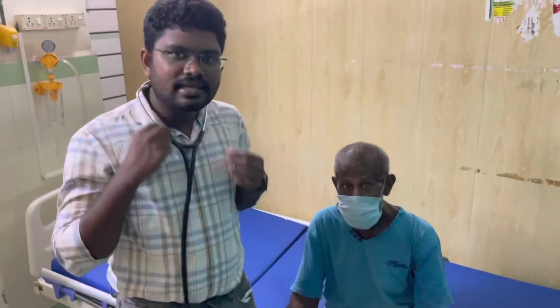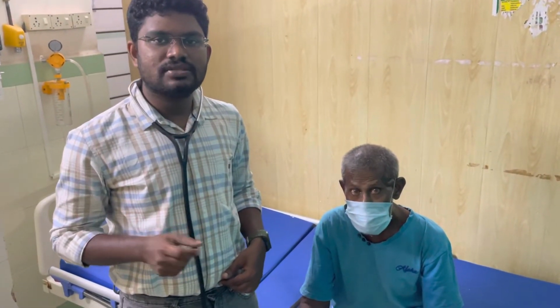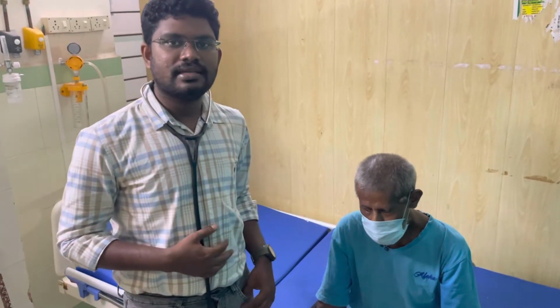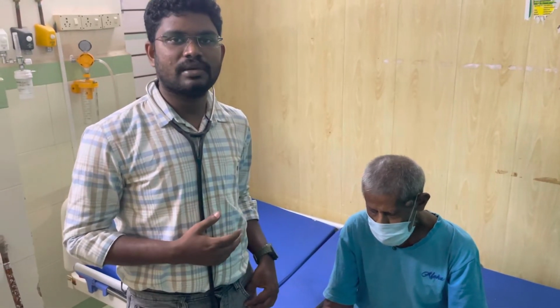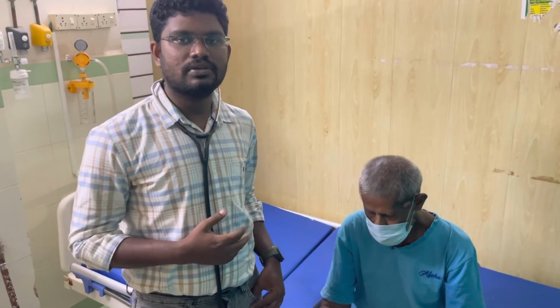So here in the axilla there is S1 and S2. There is no murmur in between the S1 and S2. That is, in systole we cannot hear the murmur in the axilla in this patient. So the murmur is not radiated to the axilla. So we can differentiate the mitral regurgitation murmur from the aortic stenotic murmur due to the absence of radiation of the murmur to the axilla.